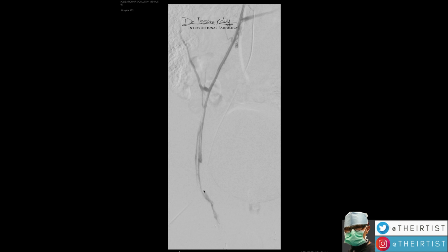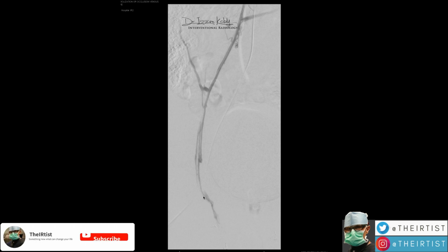So how does embolization differ from surgery, and how, in my humble opinion, is embolization superior? Well, you can see that we do first a snapshot venogram that shows the whole network of veins from the top to the bottom. So we can see that there are collateral veins, there are some other branches that are normal here, there are other branches. So all these things the surgeon will have a hard time to find, as he works only on an incision. The second superiority of the embolization technique is we can take care of these collateral veins. So we're going to block everything.